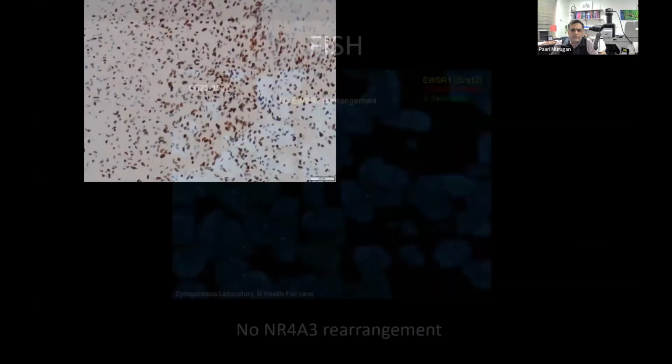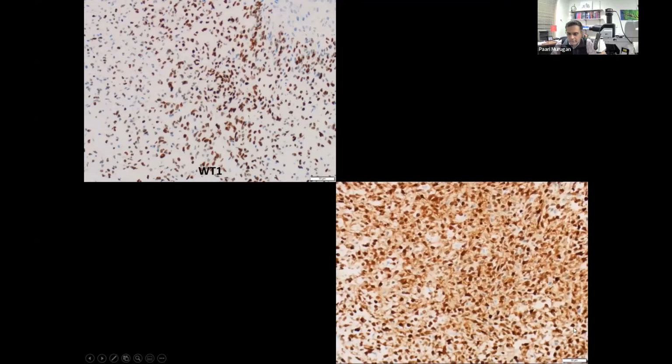And the first additional test I did was this additional immunohistochemical stain, which, as you can see, has some robust positivity in a nuclear pattern. And this stain is actually WT1. So carrying forward with this idea, with that particular diagnosis in mind, I also did another stain, which you can see right here, again, diffusely and strongly positive, but this time in both a nuclear and cytoplasmic manner. So this stain is actually calretinin. So this seems to confirm the theory that I had in mind.